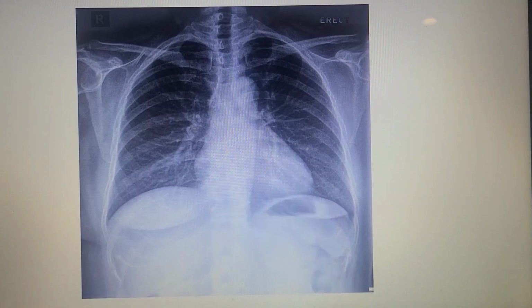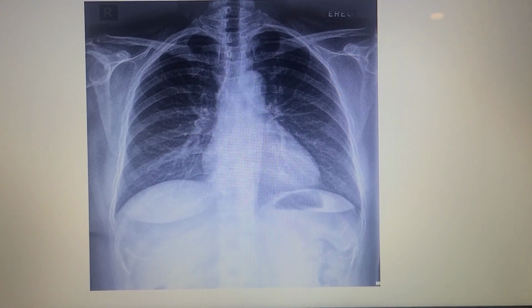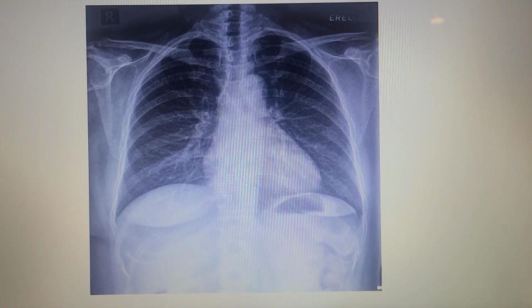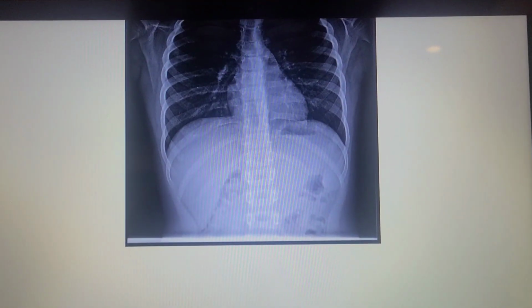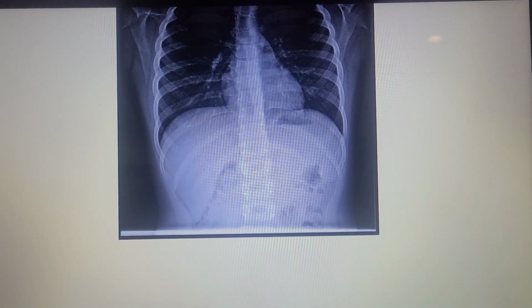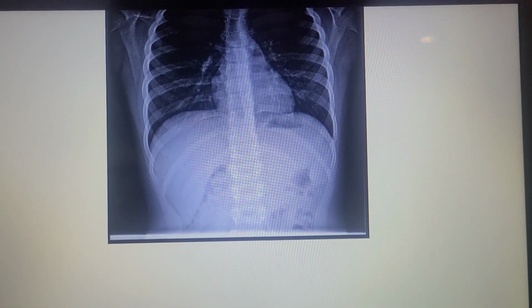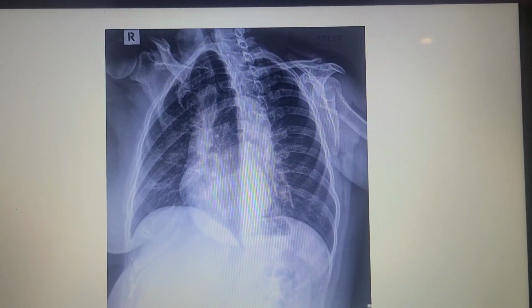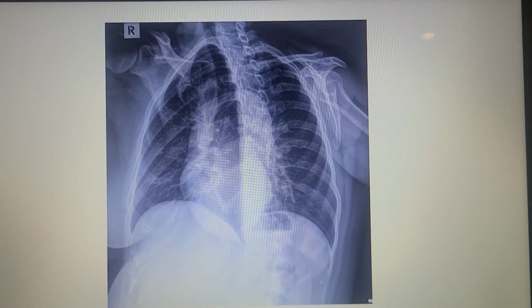Here we have some rib x-rays. As we can see, proper collimation of 14 inches by 17 inches has been employed. When imaging the upper ribs, we can see 9 posterior ribs in their entirety. This is an indication that the proper breathing technique has been utilized. When examining our lower posterior ribs, we can see how effective our exposure at full expiration was, as it has left significantly less overlap between the lower ribs and the diaphragm, resulting in a clear image of those ribs. Lastly, our oblique projections show our axillary ribs free of superimposition of the thoracic vertebra.